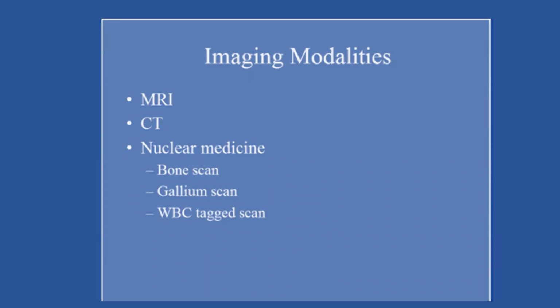Dynamic MRI. Yeah. Let me tell you. His question is very nice and very good. But dynamic MRI is not very new, but we really need it in orthopedics. We really need it. And it is used to evaluate instability. What do I mean by instability? We use it a lot in the spine. When we have an unstable vertebra slipping on the other, we ask the patient to do a dynamic MRI in flexion and extension. This is something which is important. Anything where you need movement in association with diagnosis, dynamic MRI is excellent. But it gives us less resolution.